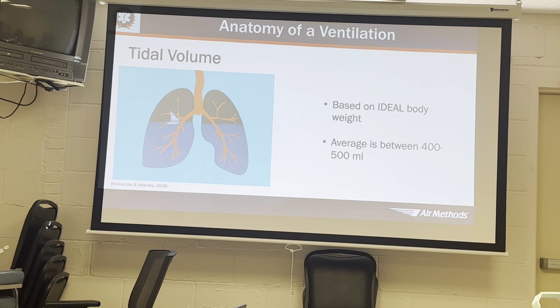So giving large amounts of volume can cause damage and injury. And not only that, but now we're clearing a lot more CO2 from their bloodstream, and so we're potentially making her hypocapnic as well. So this just kind of illustrates we should be targeting an ideal body weight, and then basing our volumes off of that.